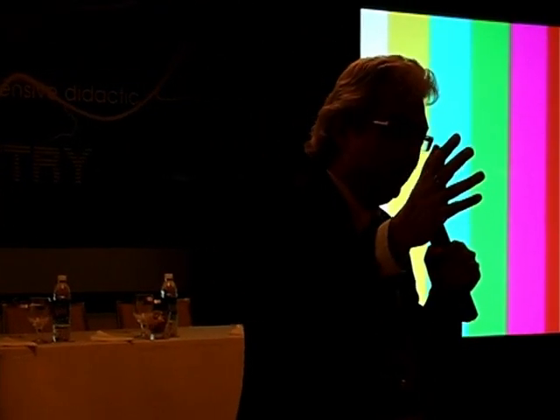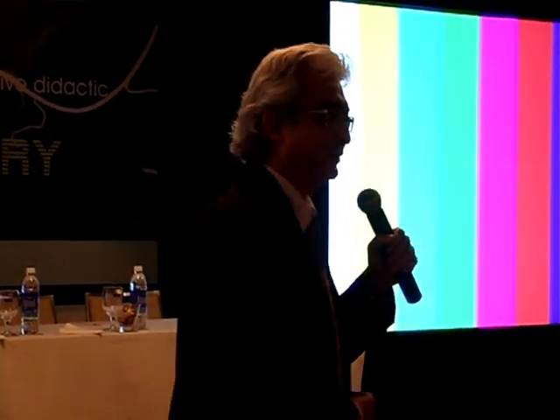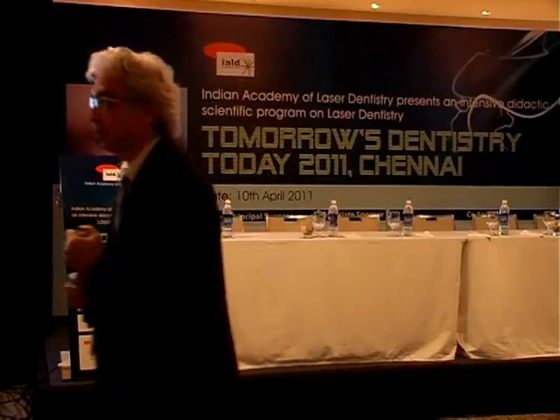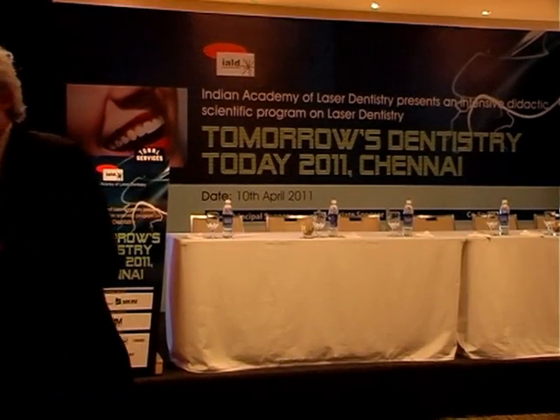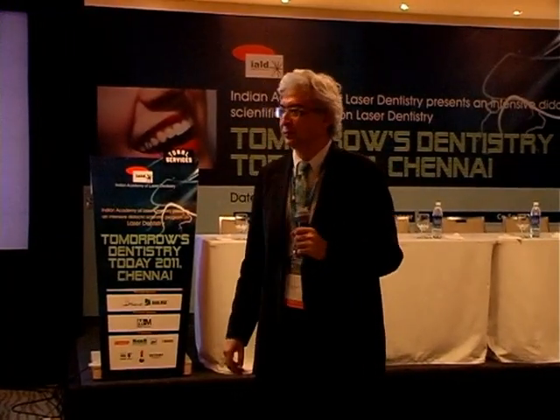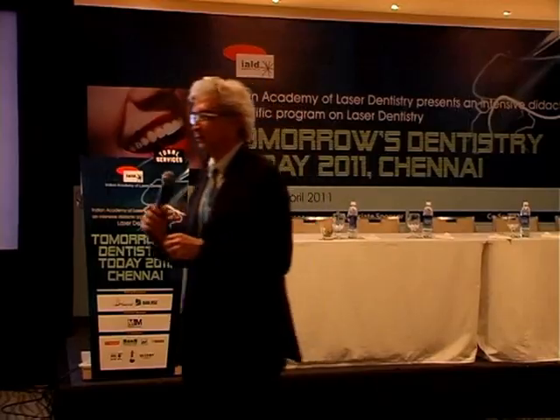The frenectomy will be the 3rd laser, and then you can see for yourself the wavelengths and how, in my personal experience, everything works. But you need to see that for yourself. I think we will start in the lower with the frenectomy, because one of the lasers is directly ready to start. But before we do this, we will give an infiltration anesthesia, because it will hurt without anesthesia. So we'll make a little shot and perhaps a little bit of surface anesthesia.